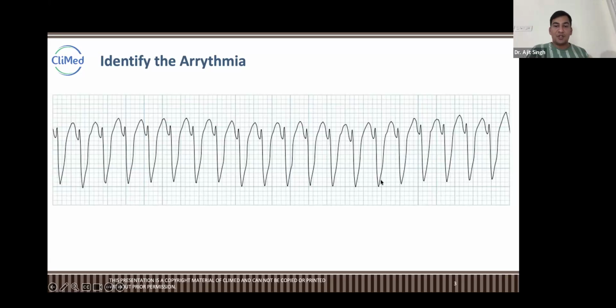Yes, Rashmi Dorji, this is ventricular tachycardia. Okay. This is ventricular tachycardia. So ventricular tachycardias are generated or originated from the ventricles. Okay, ventricles doesn't mean that from inside the ventricles.